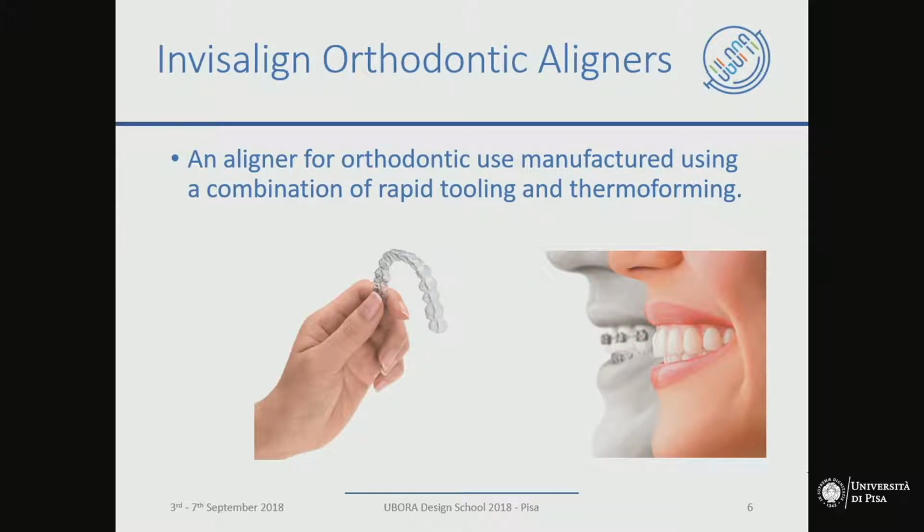I don't know how many of you are aware of the Invisalign orthodontic device. Is it 3D printed? How many say yes? This is a personalized medical device. Is it 3D printed? How many are for yes? 1, 2, 3, 4, 5, 6.